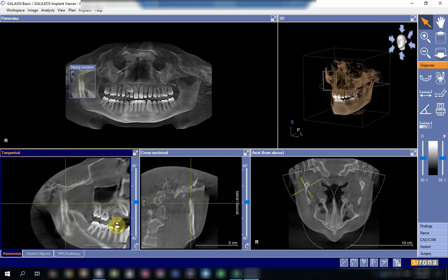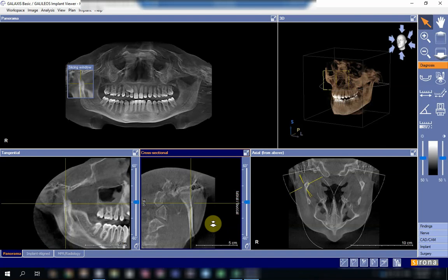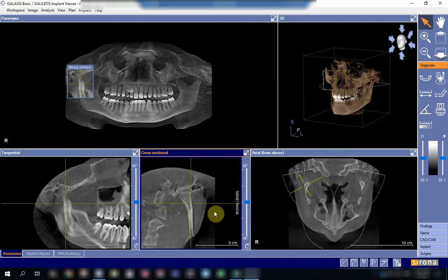By the way, fracture — radiographically speaking — is defined as a discontinuity in the anatomical outline of the structure. Usually it is a sharp radiolucency that causes discontinuity through either all the thickness of the anatomical structure or a part of it.